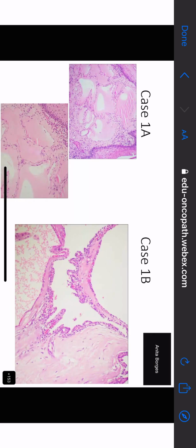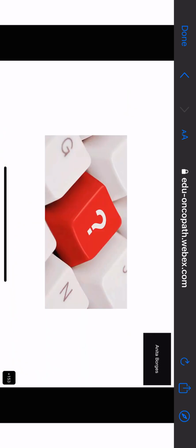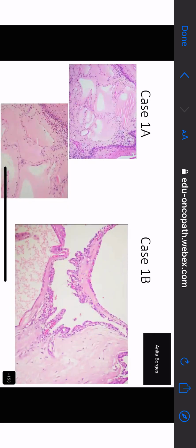Okay. So we have a difference of opinion over here. Sumeta, they think that what you think is an epithelium in 1A is actually an endothelium. There is no discrepancy about 1B. Sumeta, will you explain to them why they are wrong?